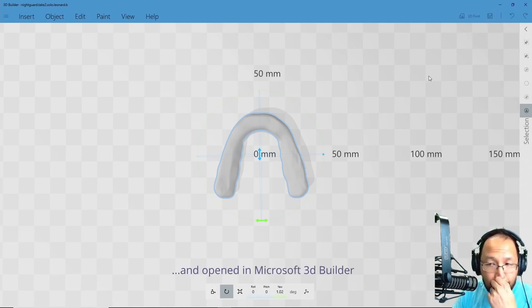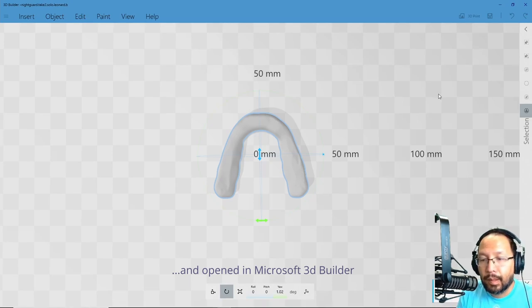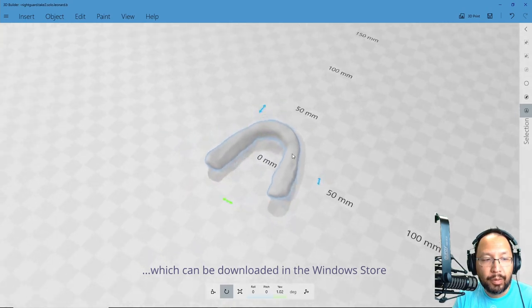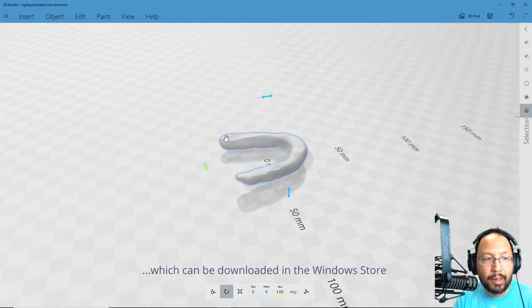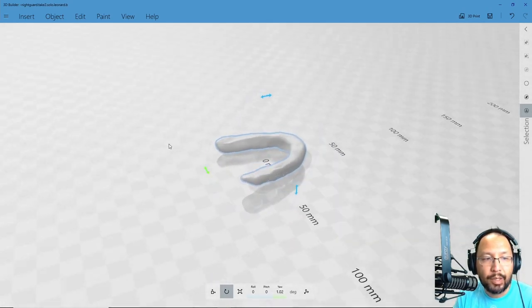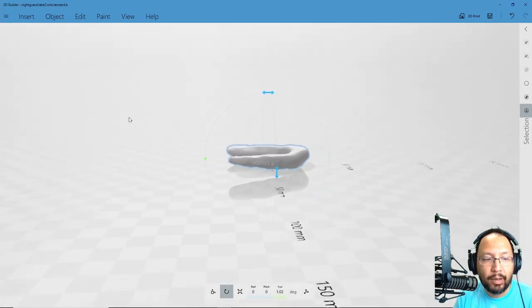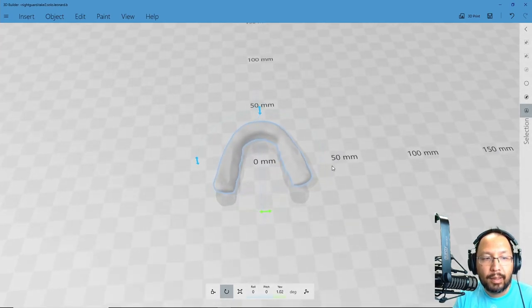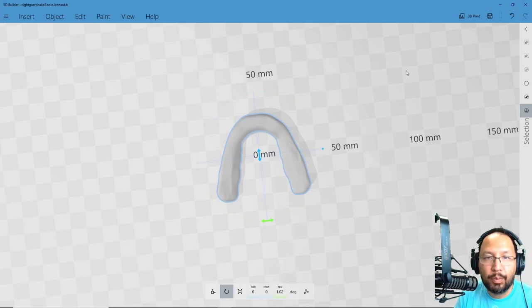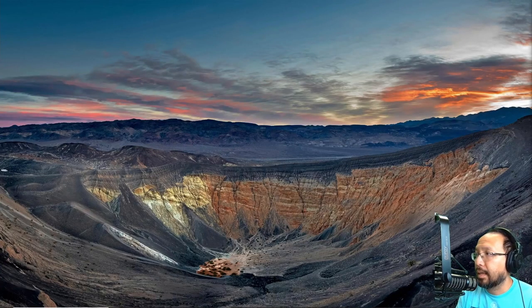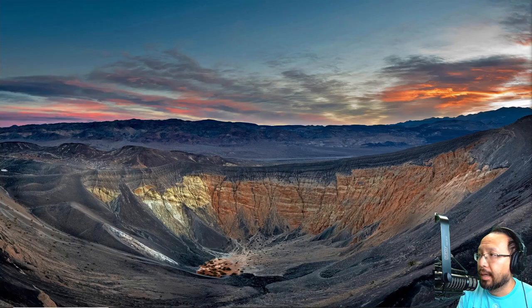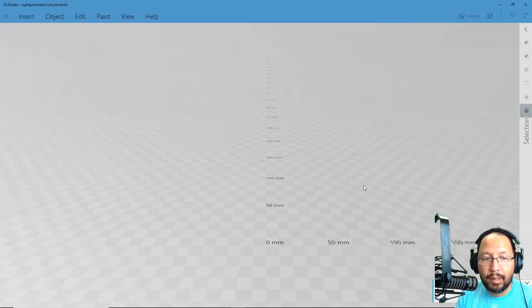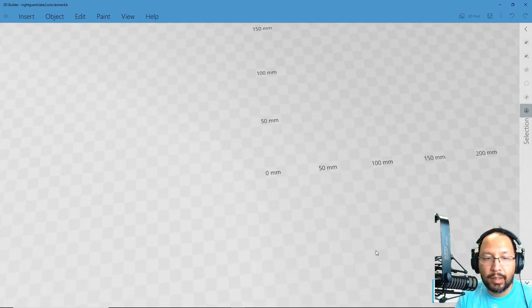The reason I'm doing that is because the Windows 3D Builder doesn't reset the axis after every rotation, so if you rotate it right now for print orientation, it's going to mess up. So I do this operation first, then I close the file, I go ahead and reopen it again, and it will reopen in the saved orientation.